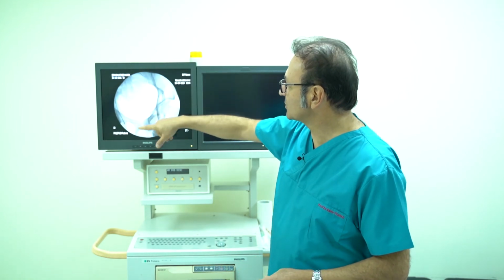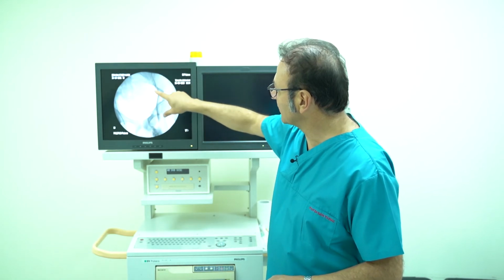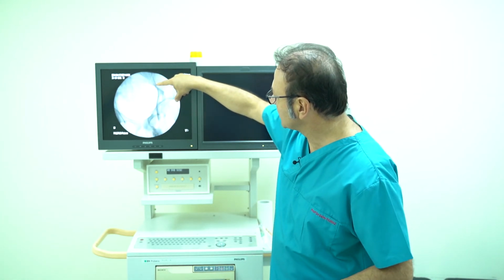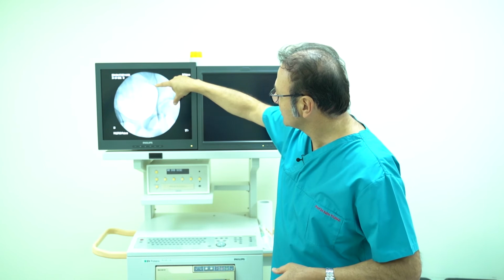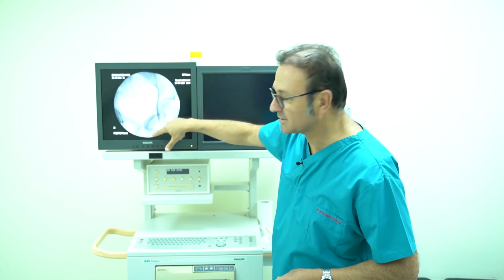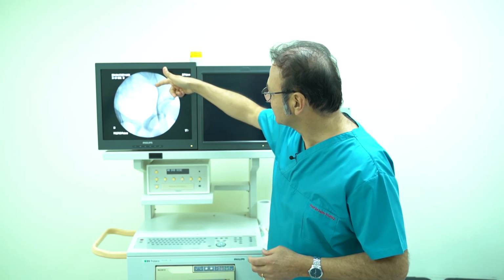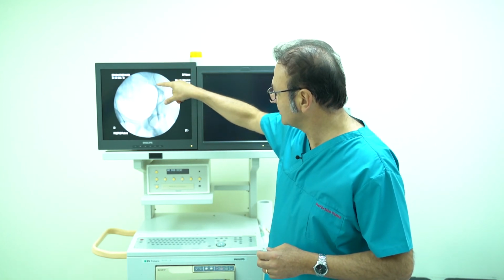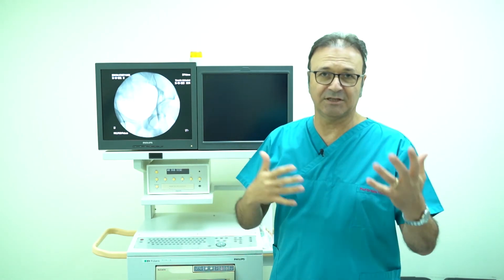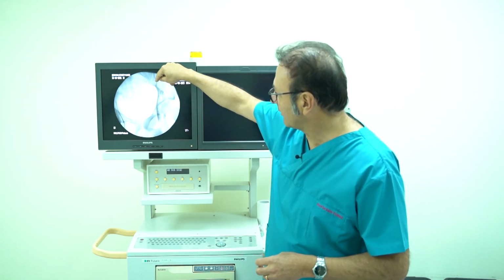For example, in this patient, we entered the catheter from the groin, and we are now in the left internal spermatic vein, and we ask the patient to strain, and as you can see here, the dye we injected comes down into the varicocele around the testicle. So in this way, we can easily identify the reason of the varicocele, the refluxing vessel, and also we can see the varicocele itself.